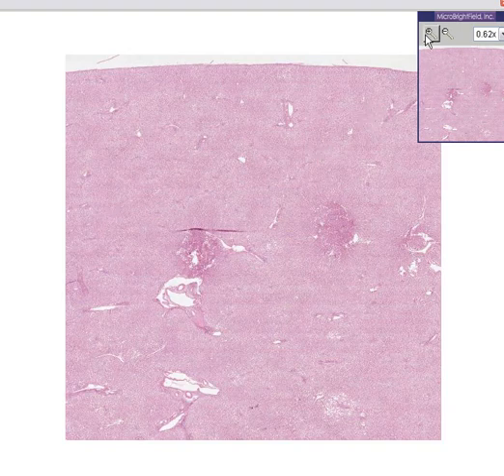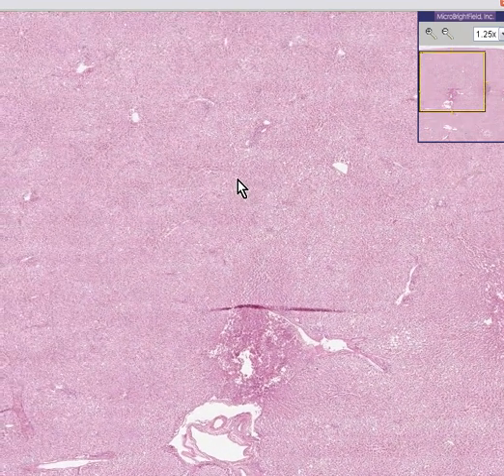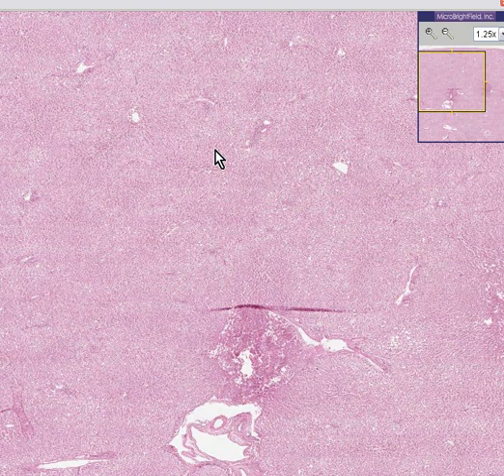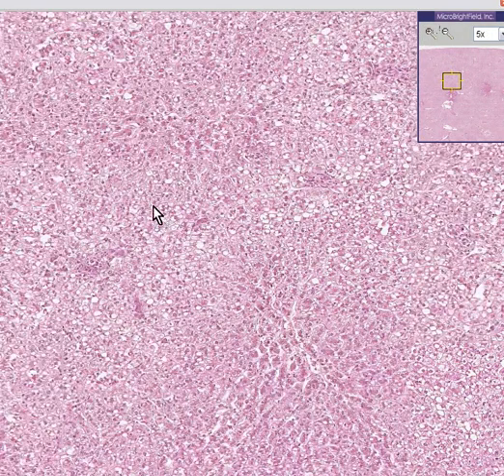In this slide, we see some tissue. I can tell you it's a liver, and after we zoom in, then you'll know it's a liver for sure. But notice that in this liver, it's not quite as pink as it usually is. Well, is that because the technician forgot to put in enough eosin into the stainer? Or is it because a large portion of the cells are vacuolated?